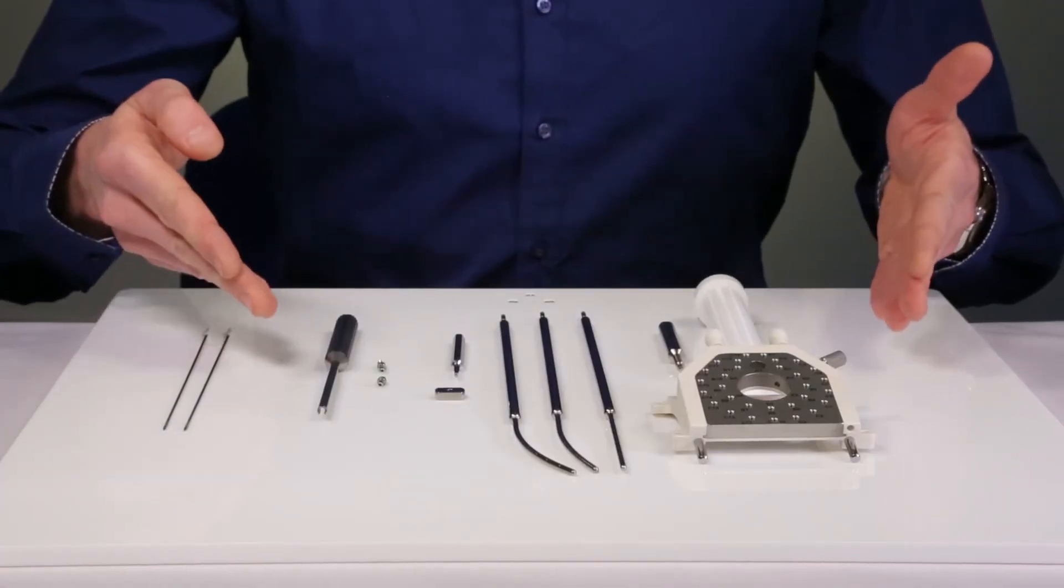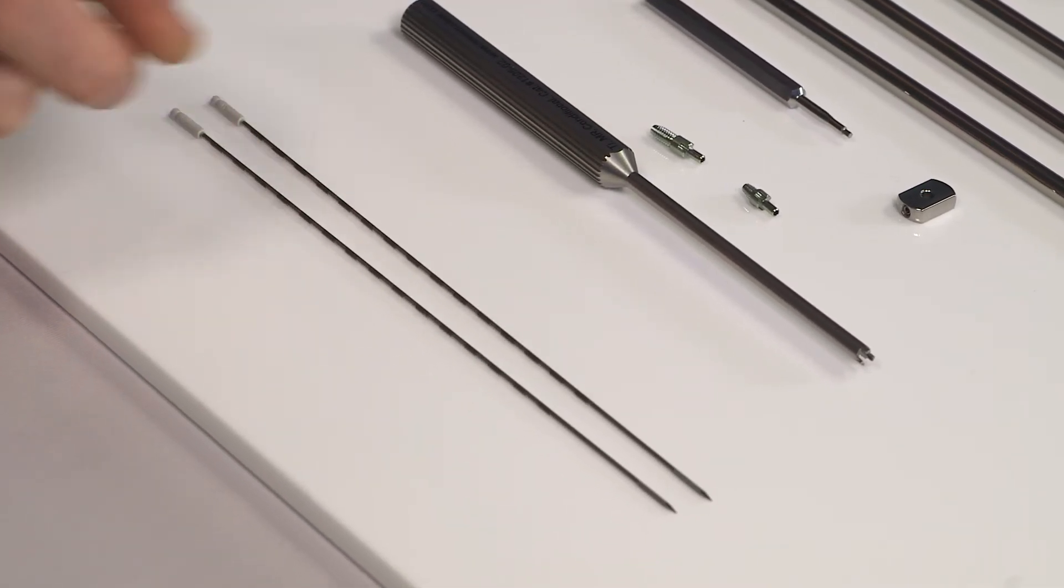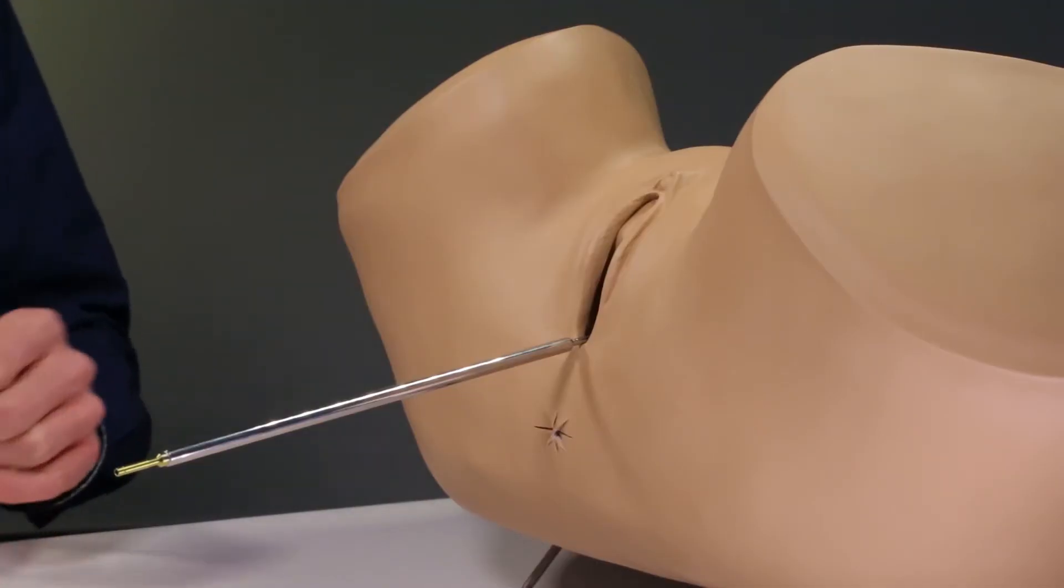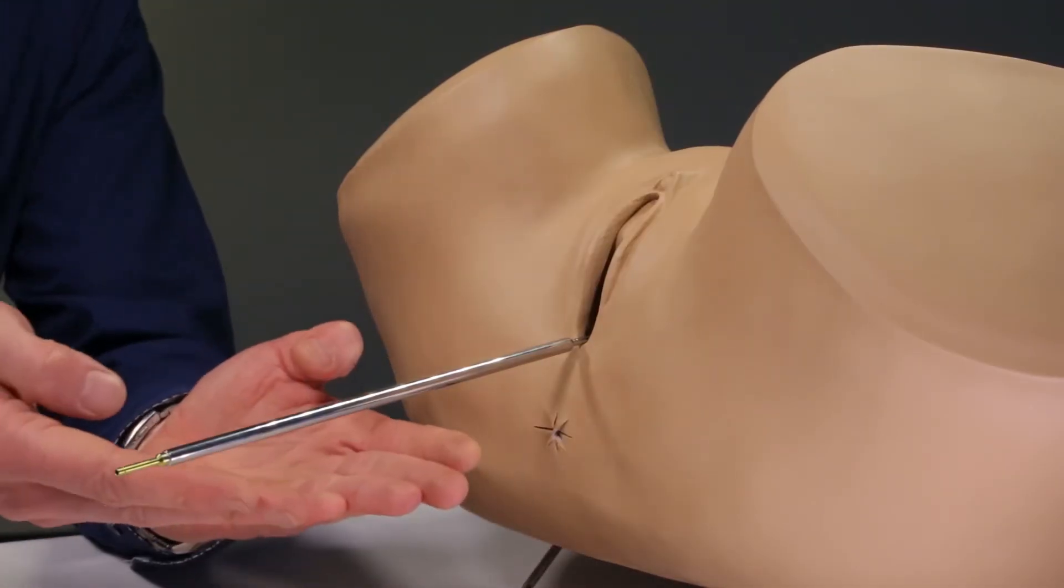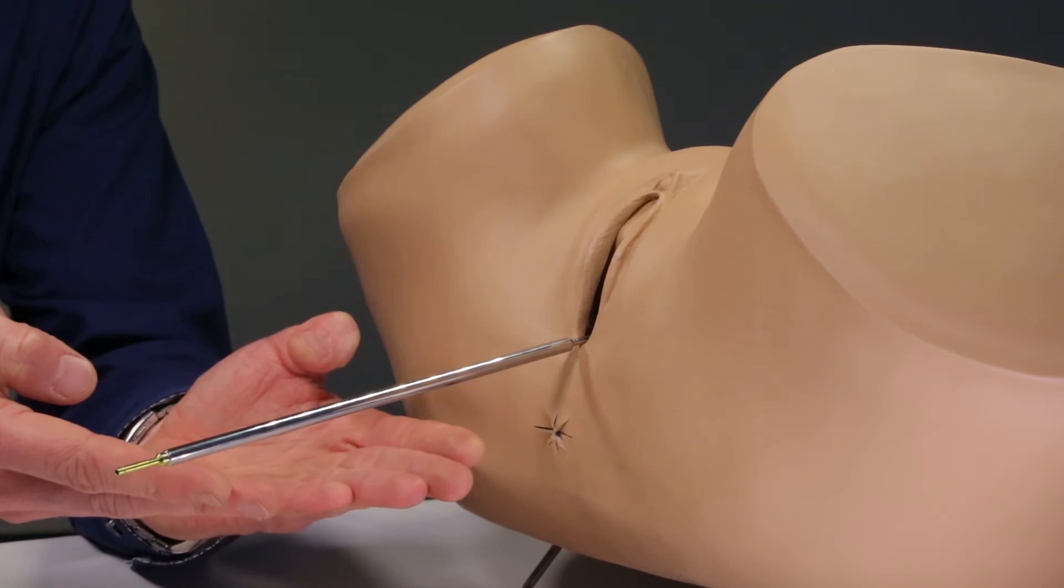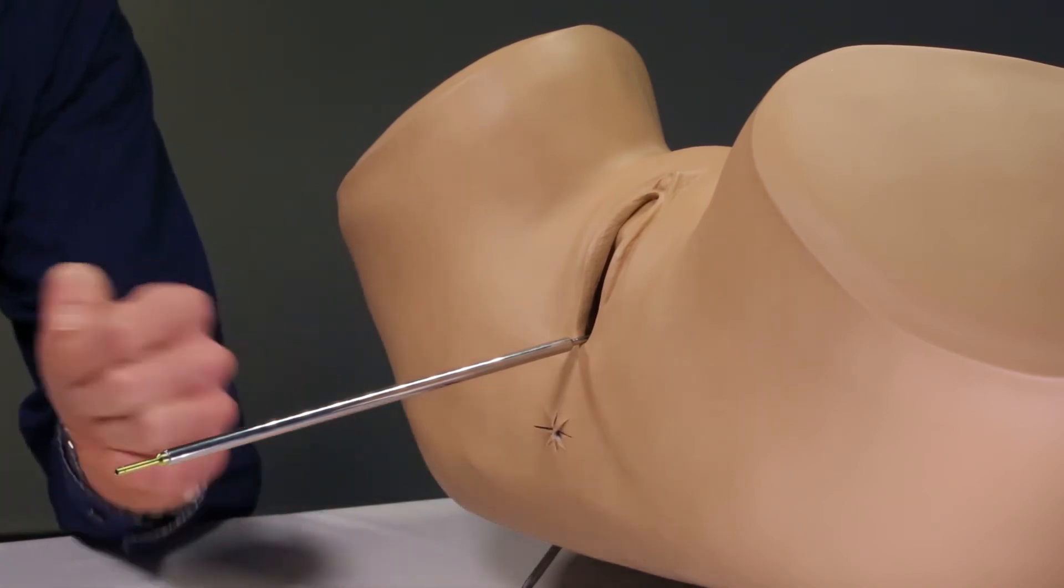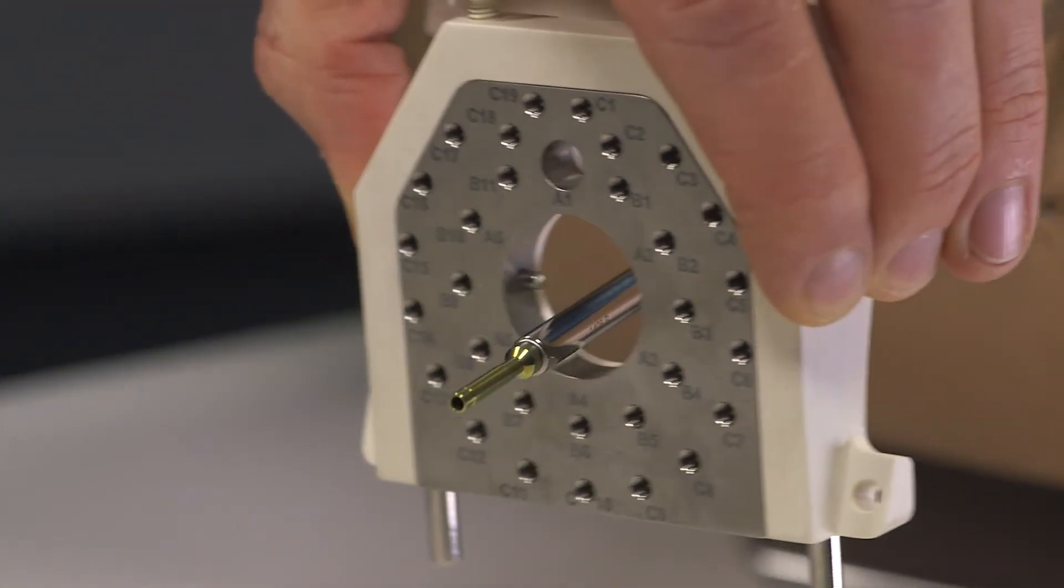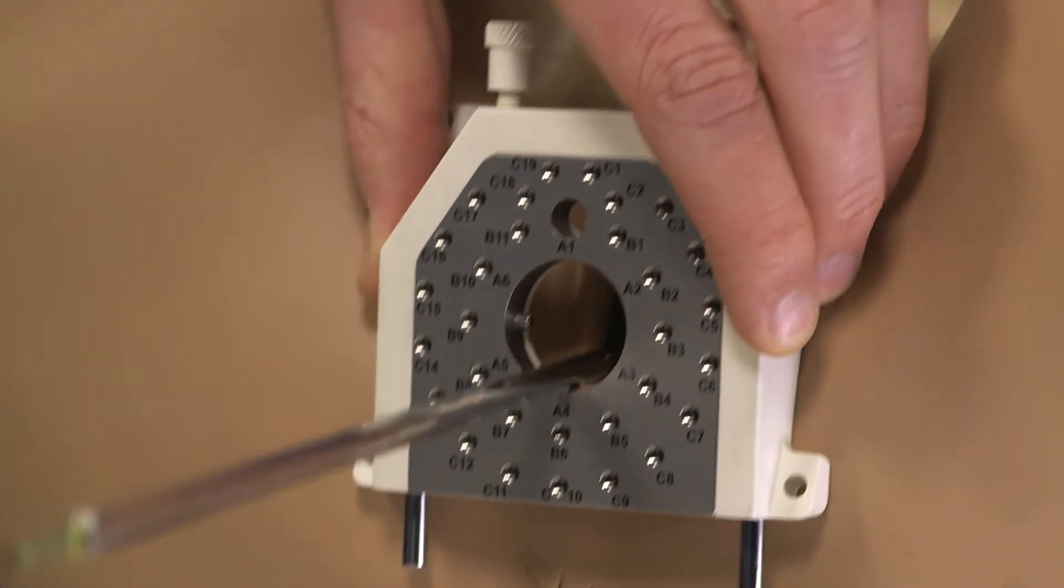In addition to the template set you will require interstitial needles. Let's begin with the assembly. We can assume that the intrauterine tube is already inserted into the patient's uterus. We begin the assembly by guiding the template through the proximal end of the IU tube to the patient's perineum.